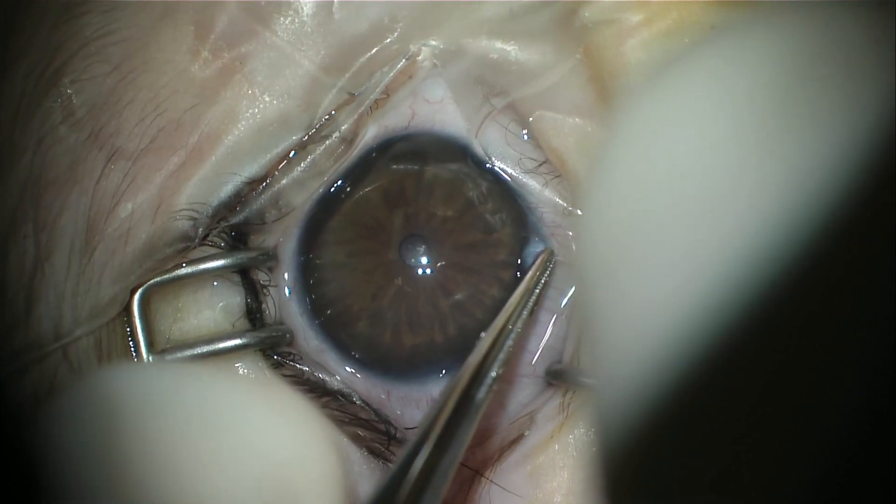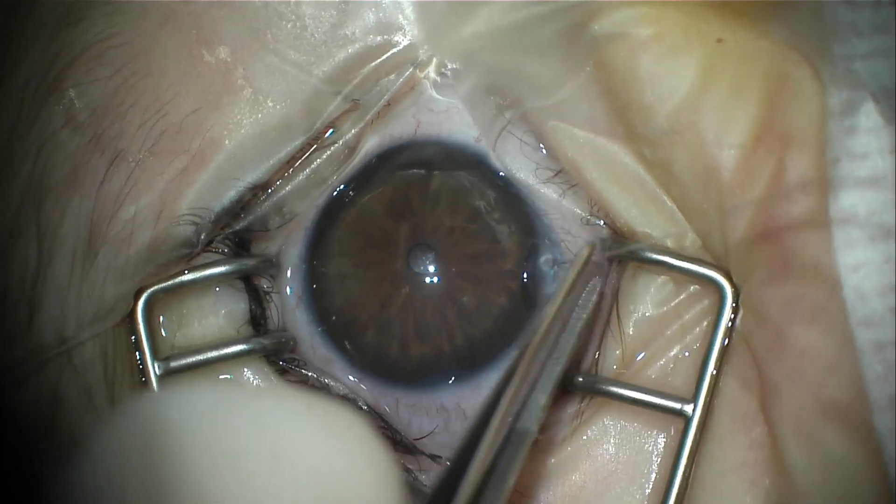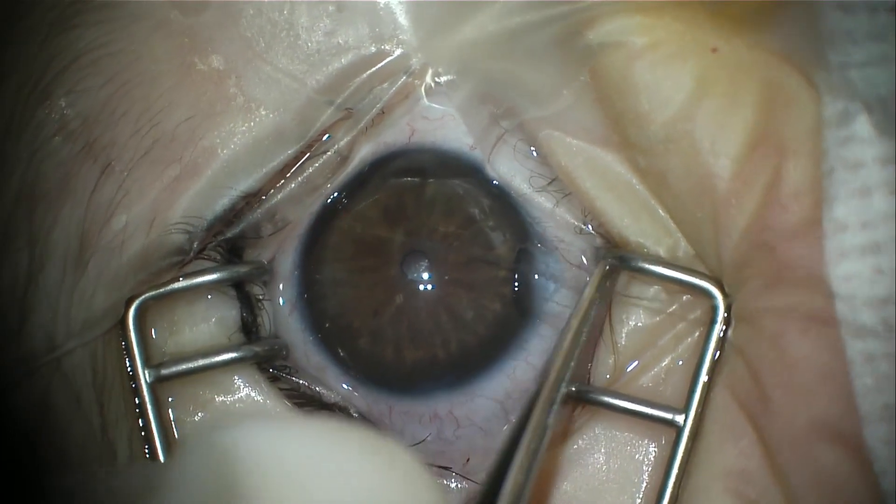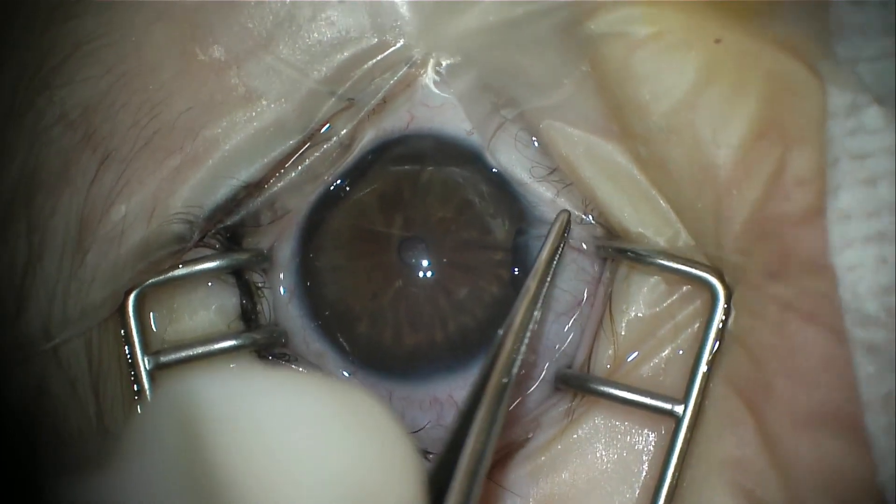In this video, surgeon Peter Chang will demonstrate what to do if the GATT procedure encounters resistance or is unable to be passed through a full 360 degrees.